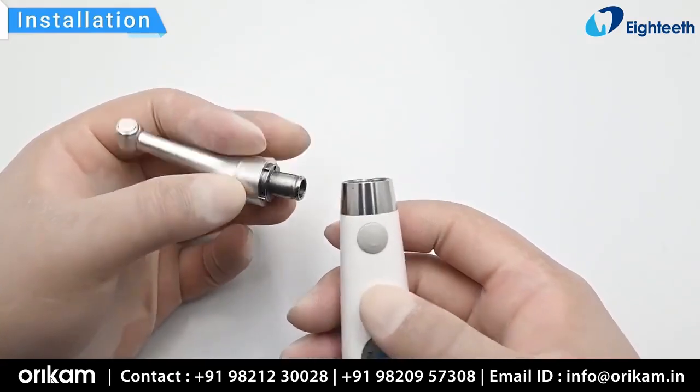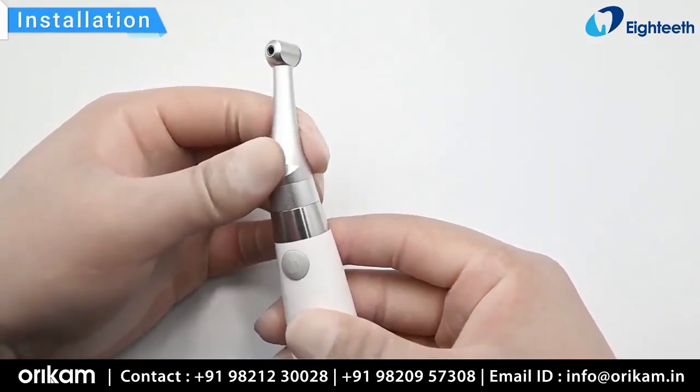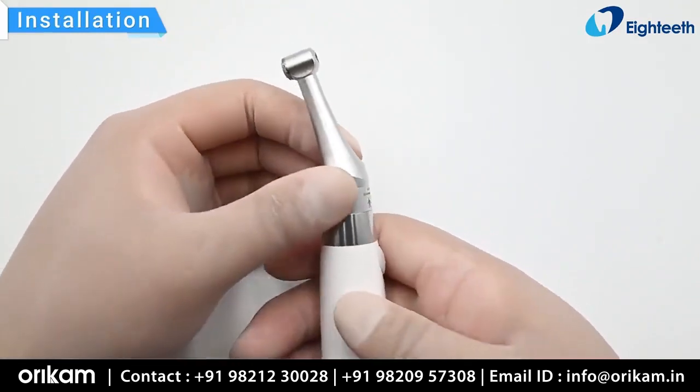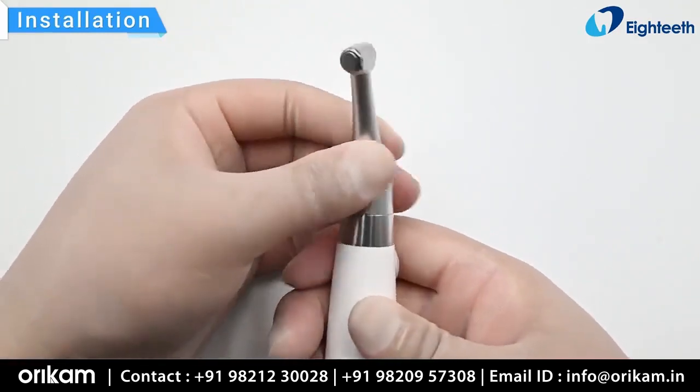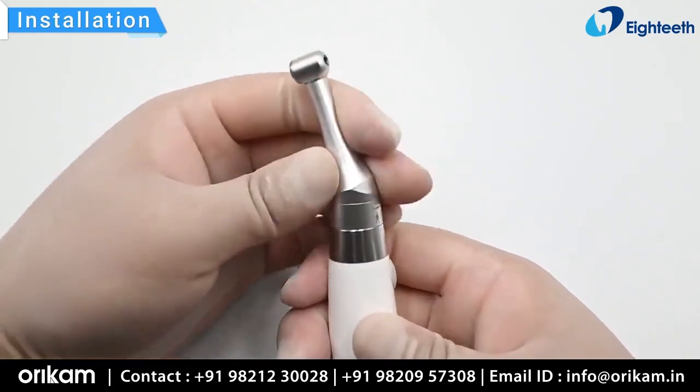Align the four positions on the contra angle with the four slots of the handpiece to install the contra angle on the handpiece. The contra angle can be rotated 360 degrees without being taken off, making it easy to view the OLED display during treatment.